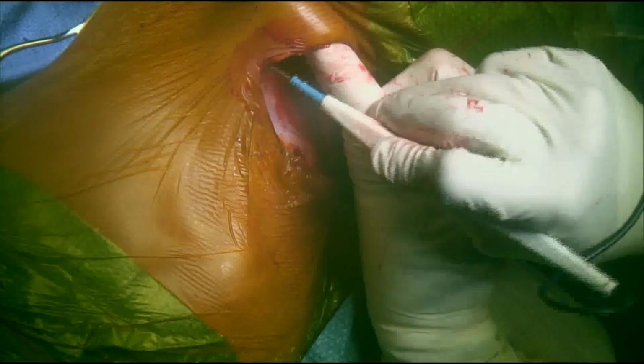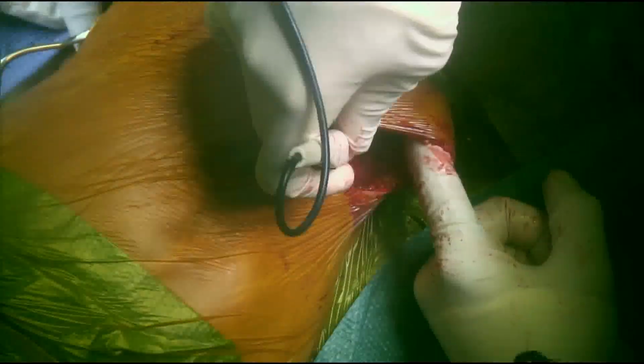You can continue to observe the fashioning of the abdominal pocket along with meticulous hemostasis. You can also see the fixation of the anchor to the deep fascia using non-absorbable sutures.